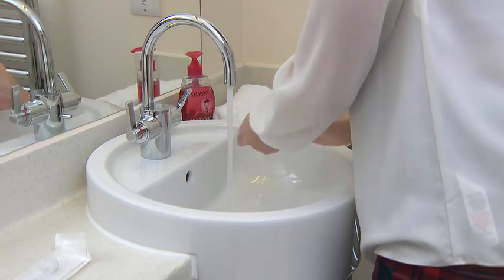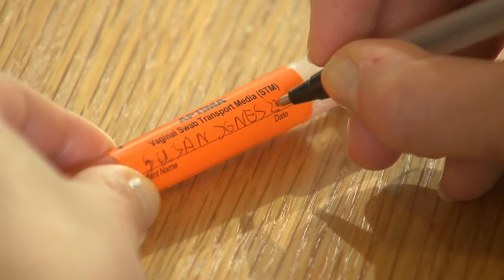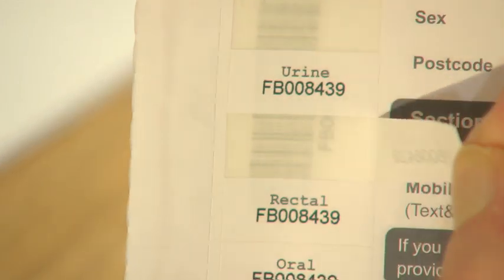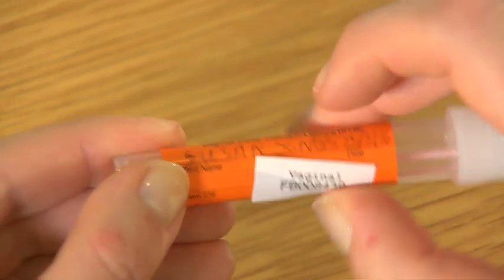Wash your hands thoroughly with warm water and soap. Write your name and the date of the sample collection on the tube. Then take the numbered sticker labeled Vaginal from the request form and attach this to the tube, being careful not to cover up your name or the date.